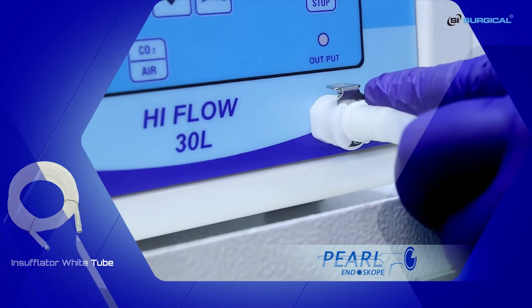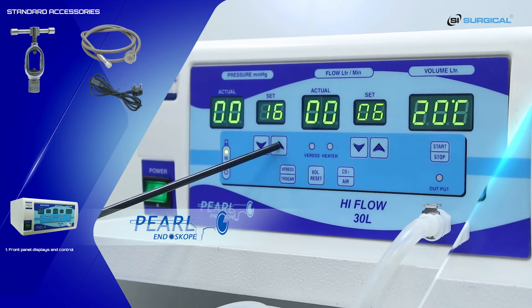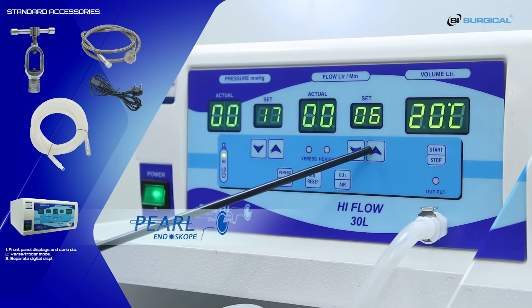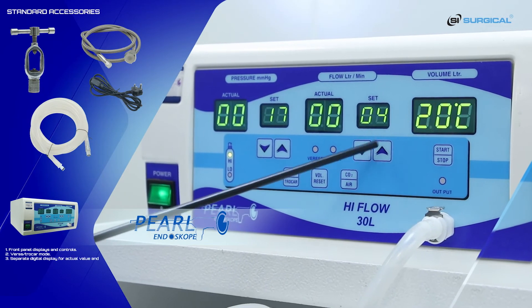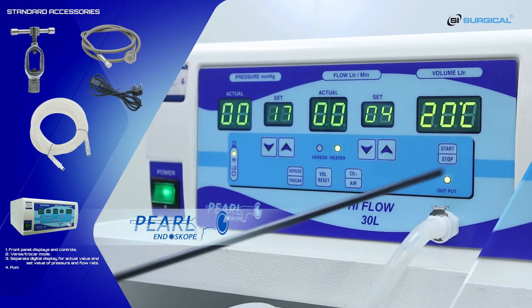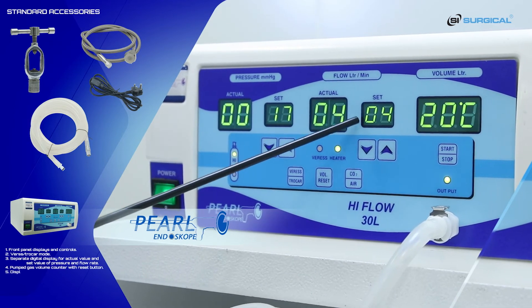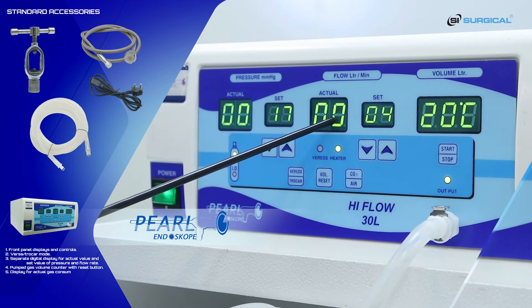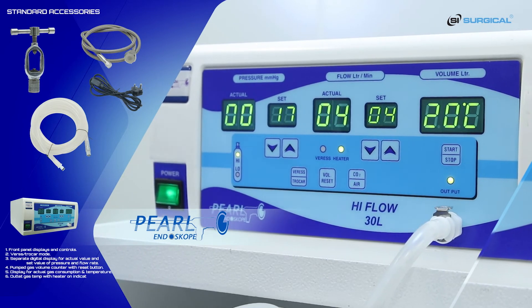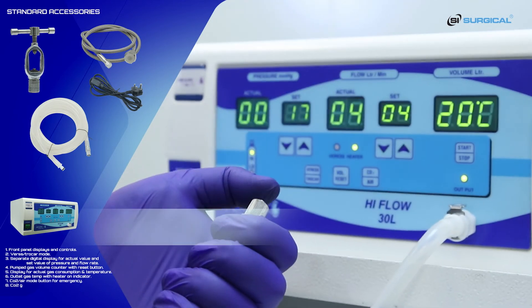We set the pressure to 17 and the flow is set to 4. The set flow and actual flow are the same. The actual pressure is zero. If we block the gas outlet pipe, the actual pressure goes up.